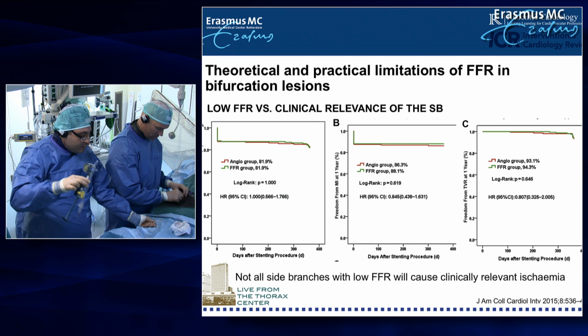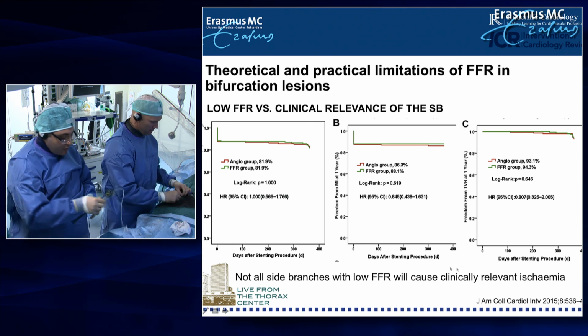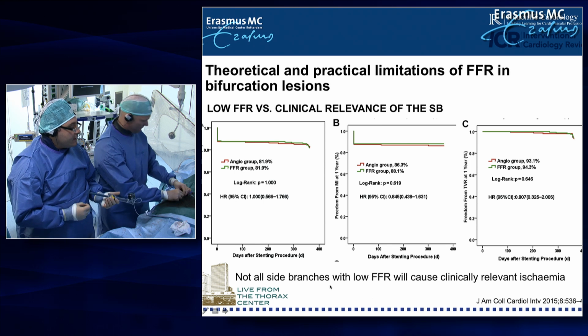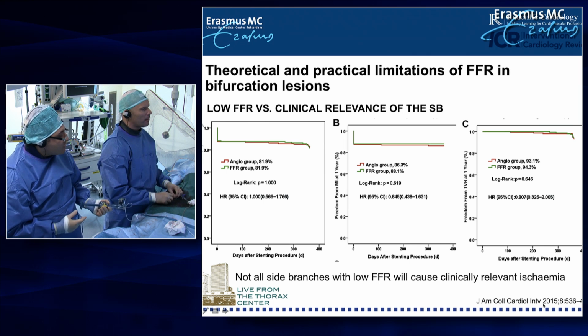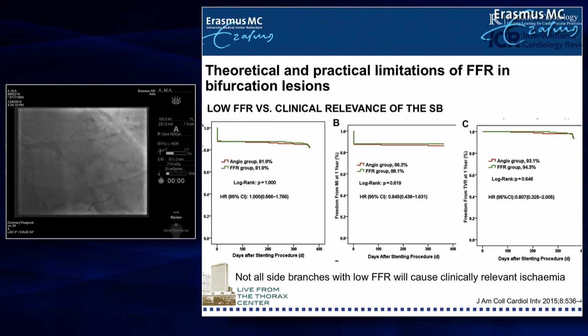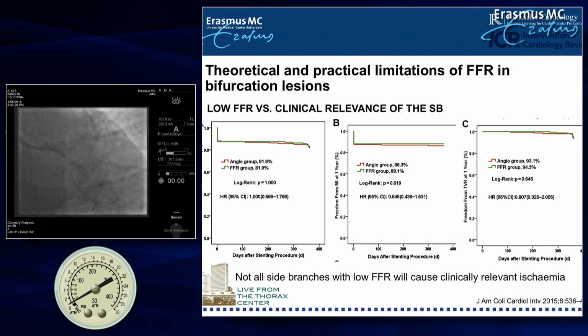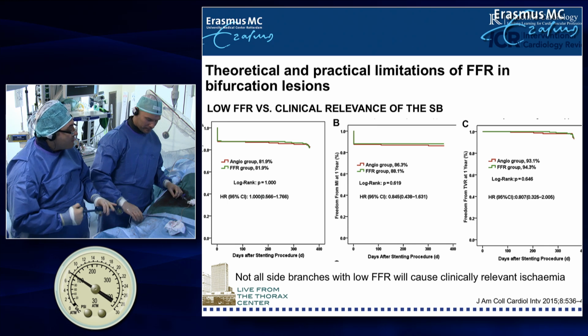I was surprised, but I also tried to understand why. I think one explanation is that the clinical relevance of a side branch is not always so high. If we consider main vessel and secondary vessel, the clinical outcomes in the long term can be less affected by disease in a side branch compared with a main vessel disease.